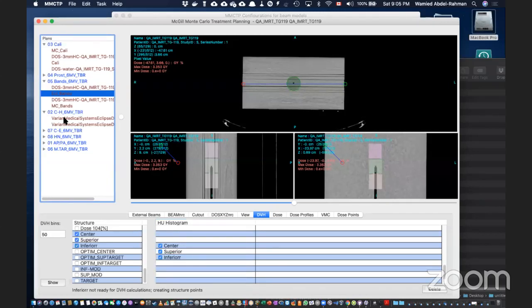I'm not sure, maybe Bilal knows about this. Yeah, there is a Plan UNC. It's a treatment planning system from University of. I have it. Yes, you can use the Plan UNC and interface with the EGSnrc, and you can display also those through this. Okay, thanks. So that planning system can interface with EGS, right? Yeah, it can do. Okay, yeah.